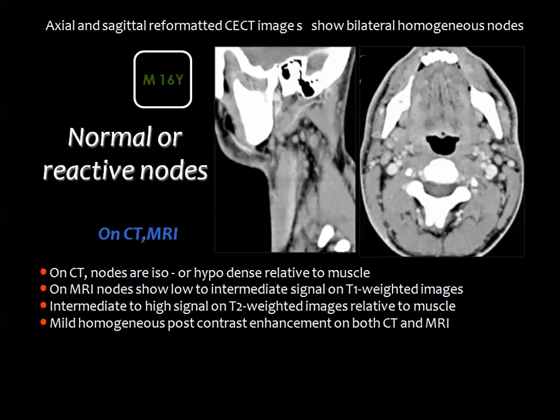It is considered one of the mistakes that you consider these nodes to belong to metastatic disease, for example, in a patient having a primary malignancy, even in the neck. Then we should be careful about nodes in the neck before saying that these are metastatic or not.